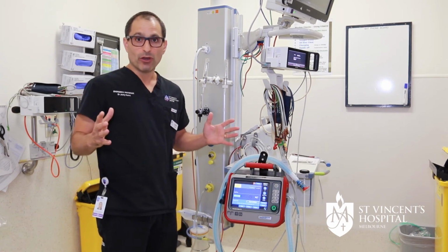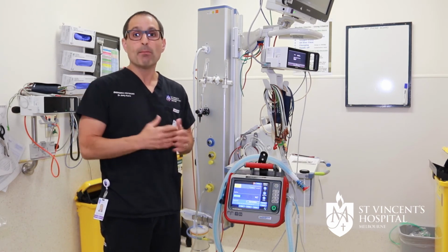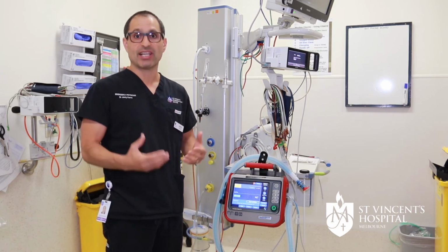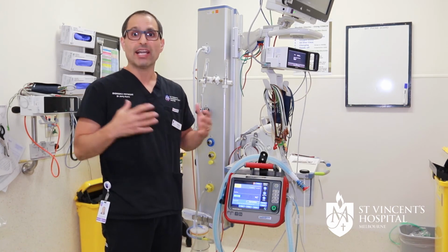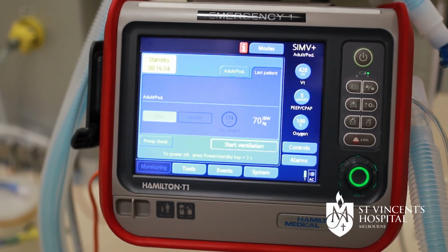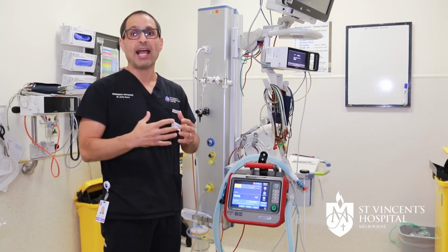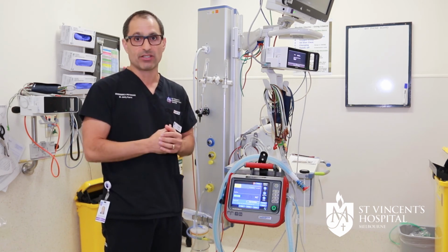As many of you would know, patients commonly require oxygen when in a hospital. Most patients can breathe for themselves and they can get enough oxygen just by us putting a face mask on in order to give enough oxygen for their bodies to function. With COVID-19, the patient's lungs fill with fluid, and no matter how much oxygen we can apply via a mask, it's not enough for the patient to survive.